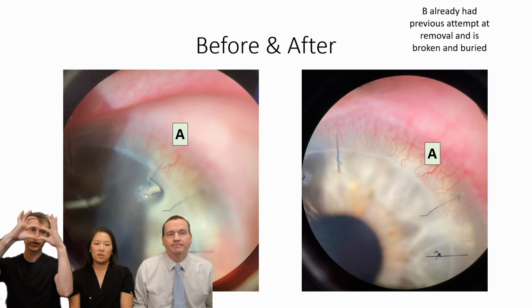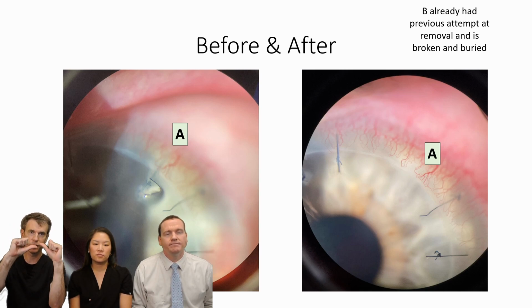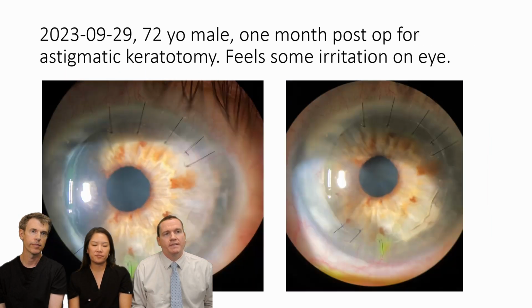Again, think of the suture like a loop. If the front part is gone and just the bottom is in, it's deep in the cornea, it doesn't bother or will ever come out because it's underneath the surface. The front part is the issue that can break through the epithelium. Any loose sutures, anything breaking up on the epithelium is a source of infection. So just remove it. Any irritation can also recruit new vascularization. So the cornea definitely will be happier if you remove it.